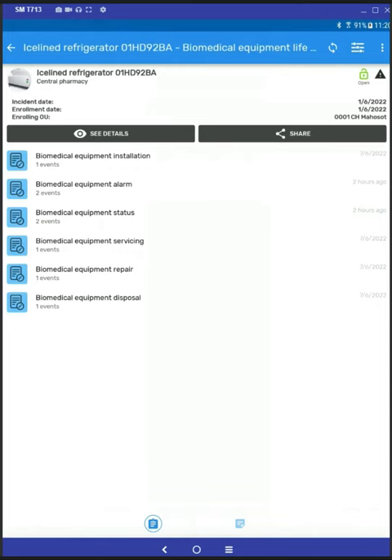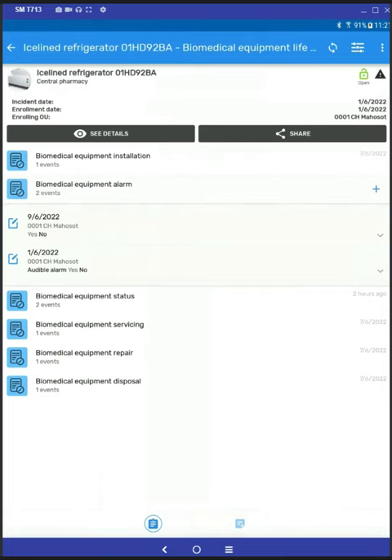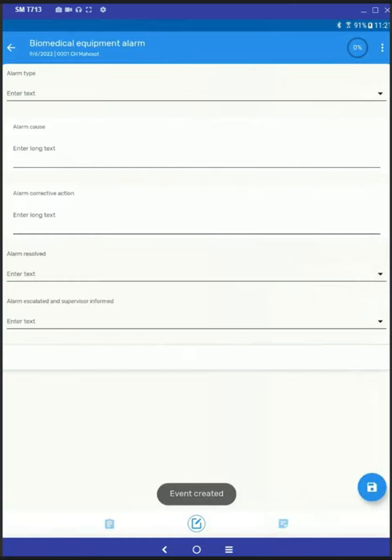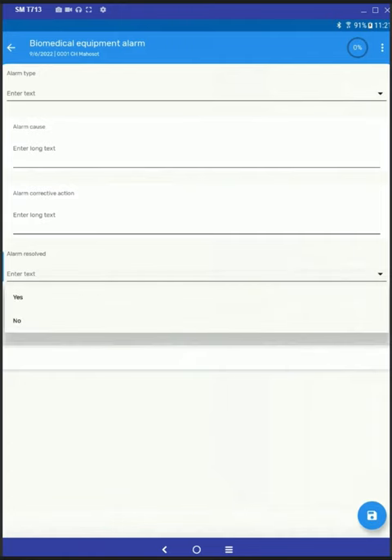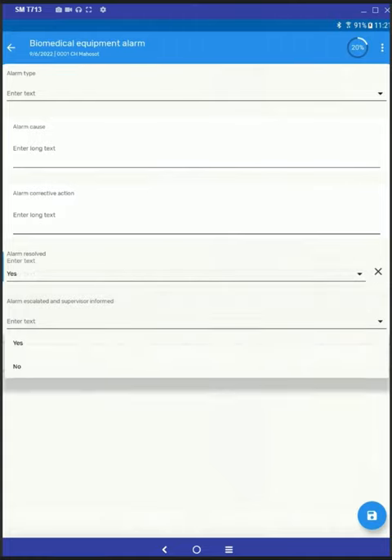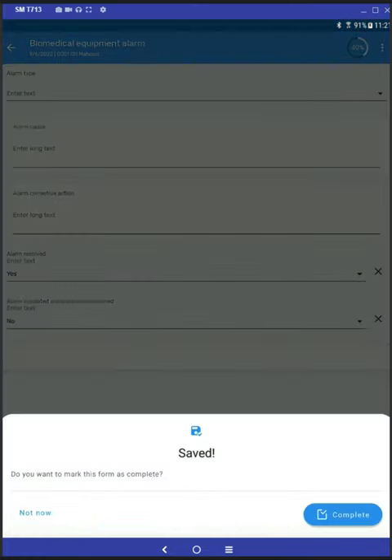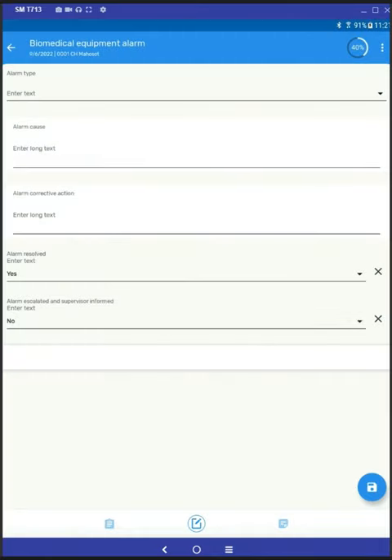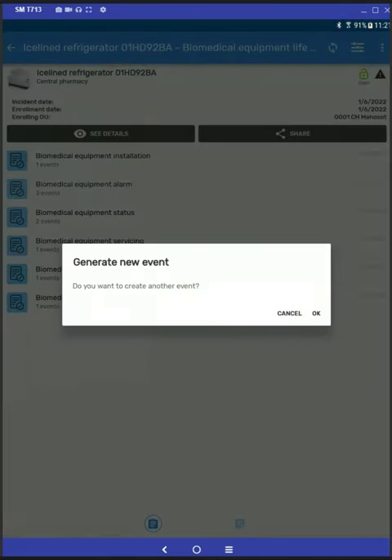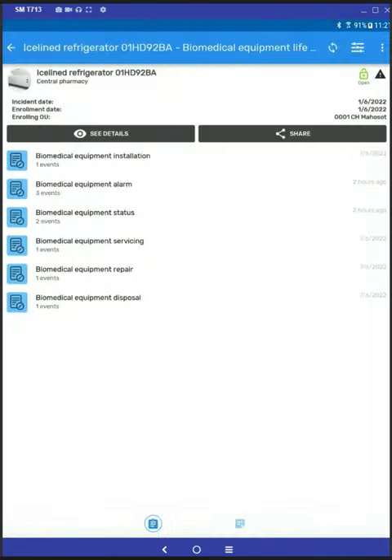So for example, if I want to record an alarm, I will click on alarm and click on the plus button and add new. And that is basically the entry for your lifecycle equipment management.